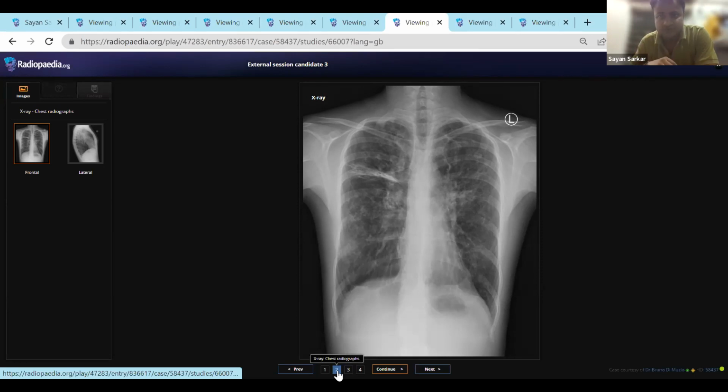So how will you follow up this case, and what are the things that you look out for? Suppose there is a known case, where will you look? So in the chest, I will look for other complications, any complication like pneumothorax, pneumomediastinum. Will you do any more imaging? Chest CT. And what will you try to see in that CT?